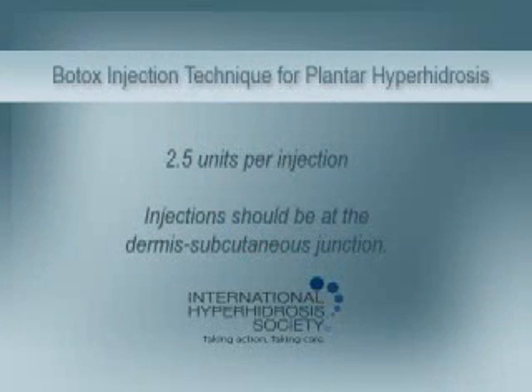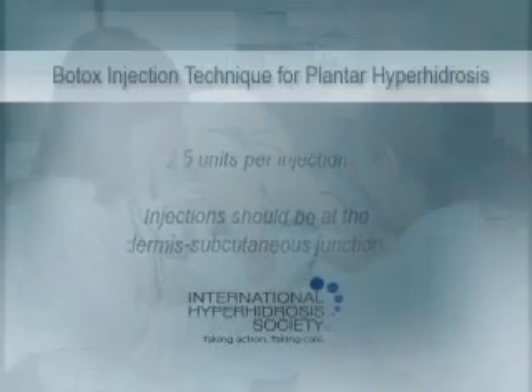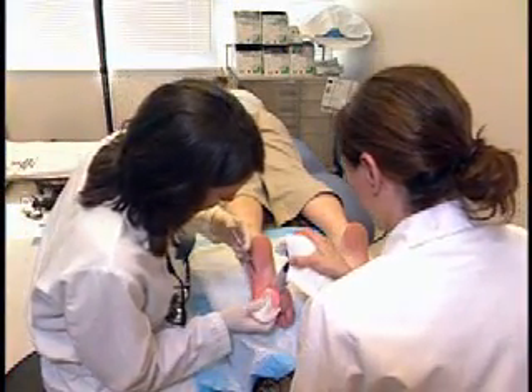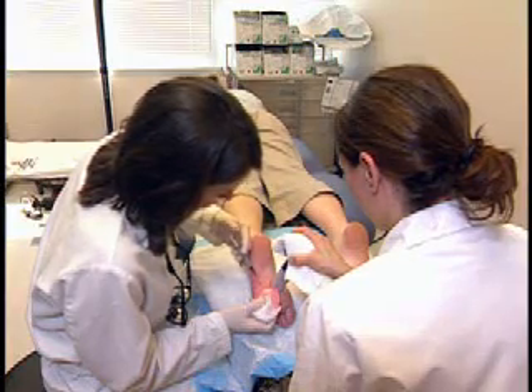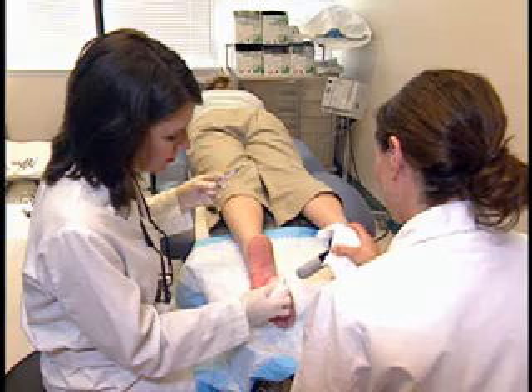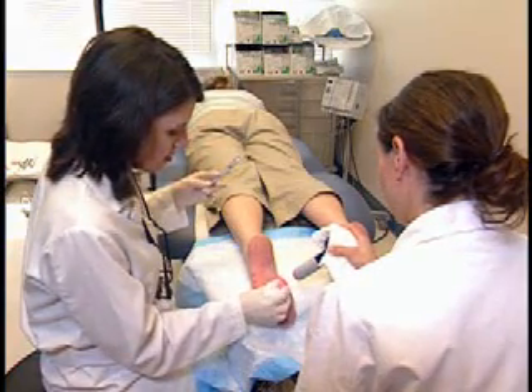Injection should be at the dermis subcutaneous junction. Do this same procedure over the entire bottom of the foot. Discomfort should be minimal and only a small amount of blood is to be expected. Counting out loud helps the patient to know when the injection is about to happen.